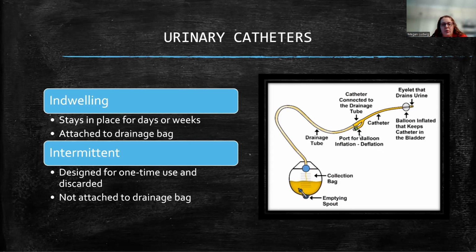The catheter itself, it's got a syringe, usually pre-filled with sterile water, not saline, sterile water to inflate the balloon with. A little bit of KY on the end of the Foley catheter, and it usually is already attached to a type of drainage bag. There's usually also a little specimen cup if you need to take a urine sample after you put it in. It should be there as well. So this is your typical setup for just a normal Foley catheter.